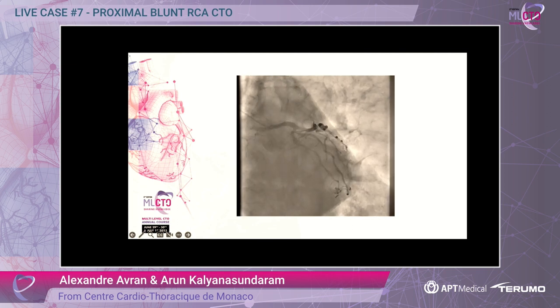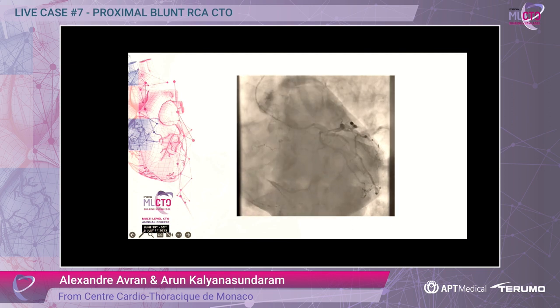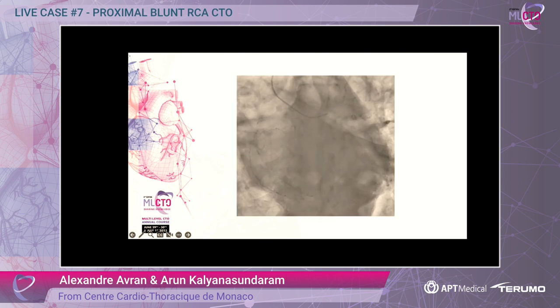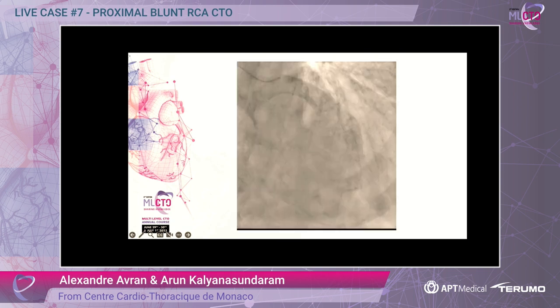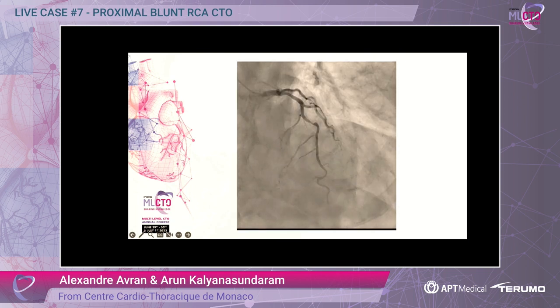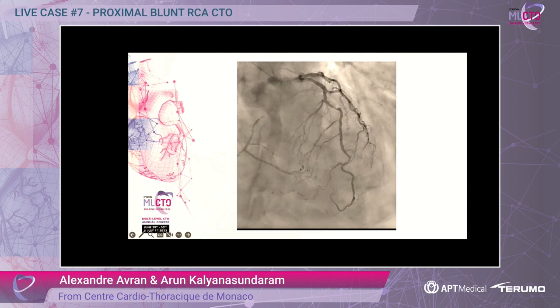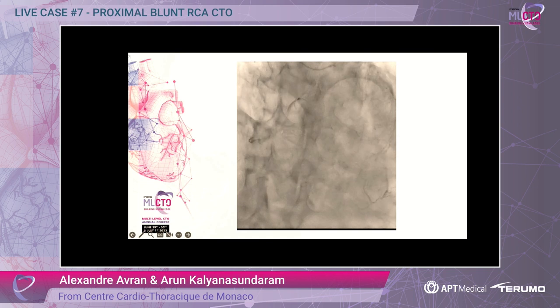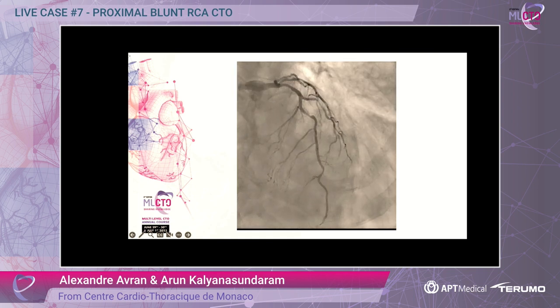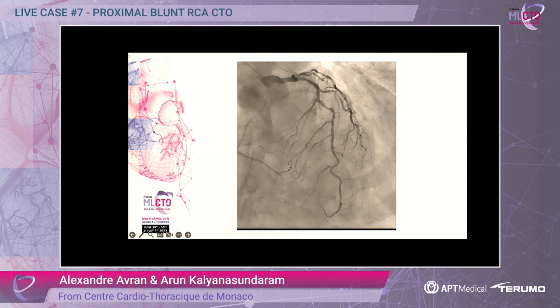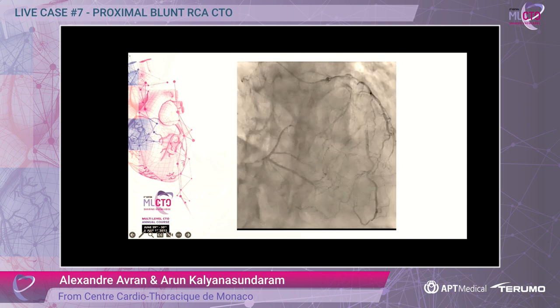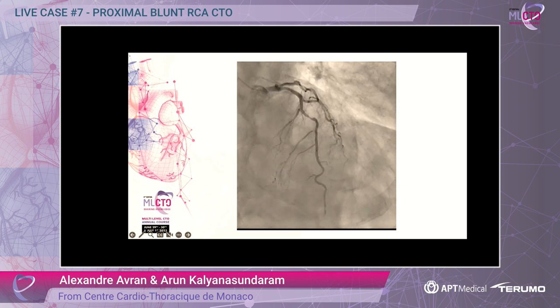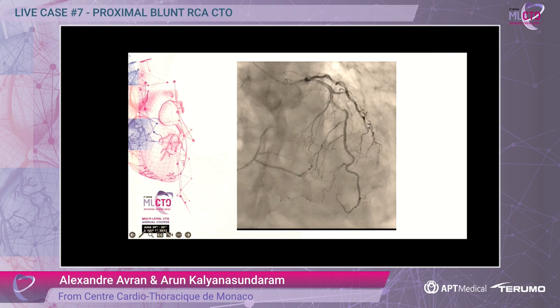On the left side, this is before stenting of the LAD and diagonal. We can see the collaterals. The LAD was fixed. We had 15 to 18 length stents. The first septal is just under the strut, but the second septal is free of strut.